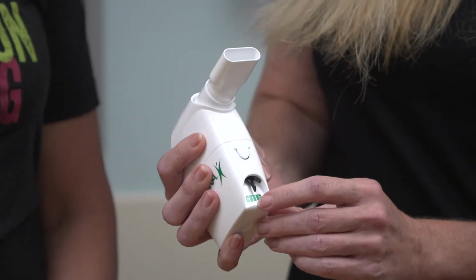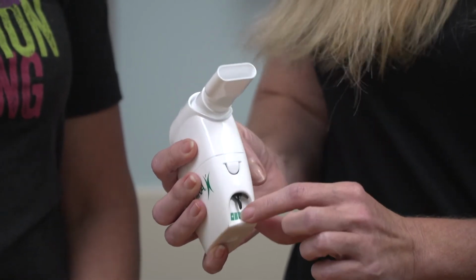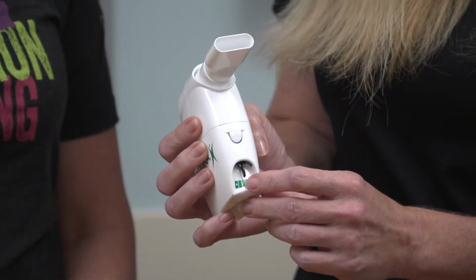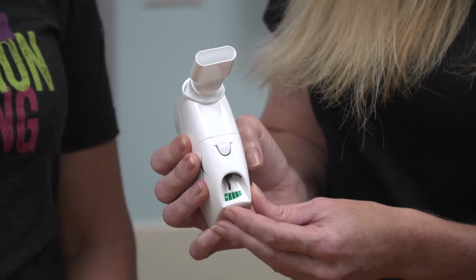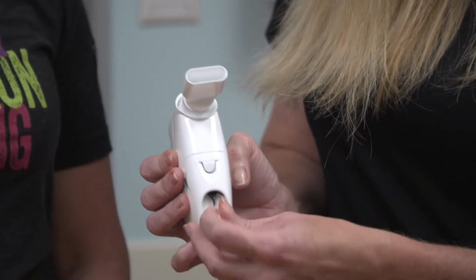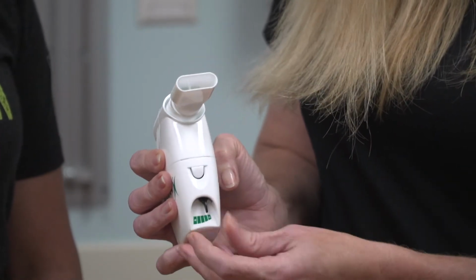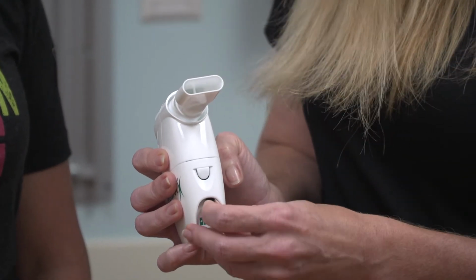When I get this device brand new out of the package, it is usually set on about 20 centimeters of water pressure, and that is a good therapeutic start. If I find that this is too easy for them, I can turn it one notch to the right, which gives it 25, and all the way over gives it 30. So back in the middle, if it is too hard for them, I can take it down a notch, which takes it down by 5 points each time too. So it would go to 15 and then 10.